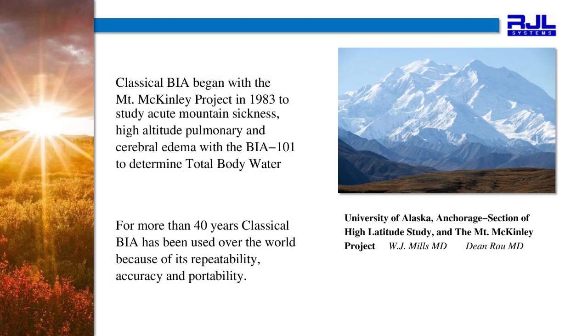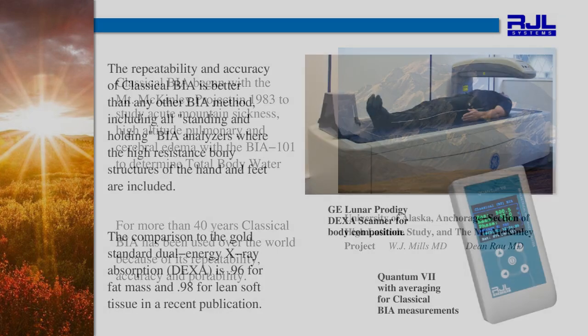Classical BIA began with the Mount McKinley project in 1983 to study acute mountain sickness, high-altitude pulmonary and cerebral edema with the BIA 101 to determine total body water. For more than 40 years, classical BIA has been used over the world because of its repeatability, accuracy, and portability.